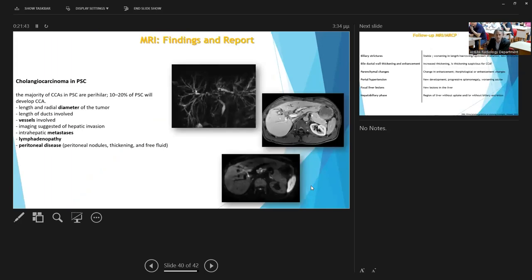Regarding the cholangiocarcinoma, that is one of the most important complications of primary sclerosing cholangitis, don't forget that the typical form is the peri-hilar form and not the mass-forming form. And when we find any cholangiocarcinoma lesion, we should write the maximum axial diameter of the lesion, the relationship with portal vein and arterial structures, and most important, we should offer the classification according to the Klatskin classification just to offer some tips to the surgeon and decide if the surgical approach could be possible or not.